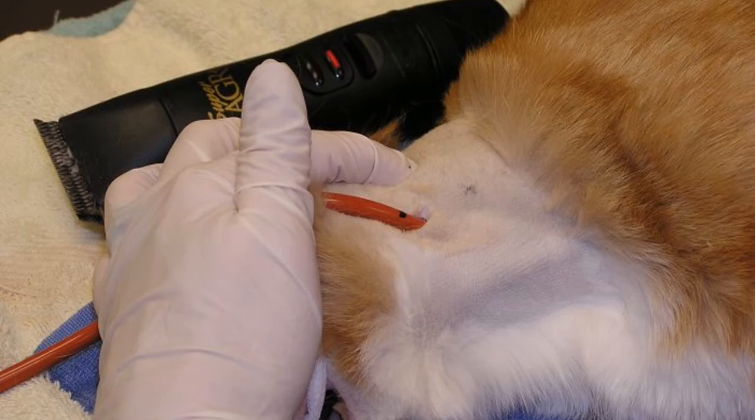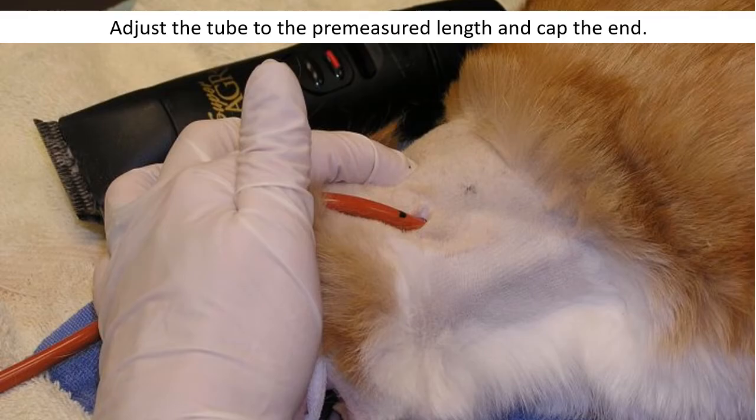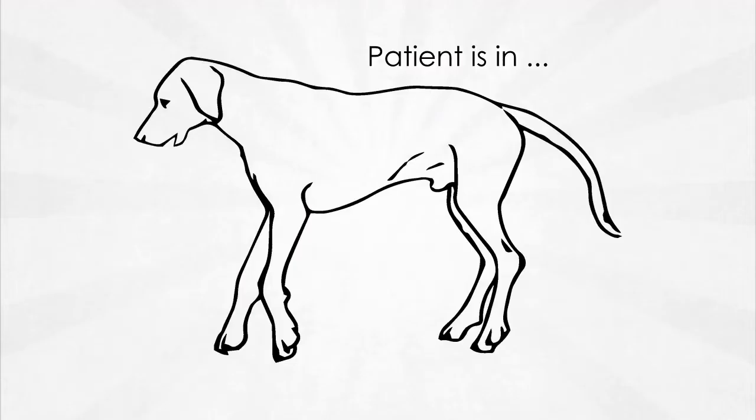Once you have redirected or reoriented the tube so that the distal tip would now be on this side, this is the head, you can see there's teeth there, and this is the proximal end of the tube. Adjust it to your pre-measured length. As you can see, this is the marker right here, right? So that you know that at this point, right, the distal end would be in between or at the level of the 7th or 8th intercostal spaces. Let's watch a video on how it is done.